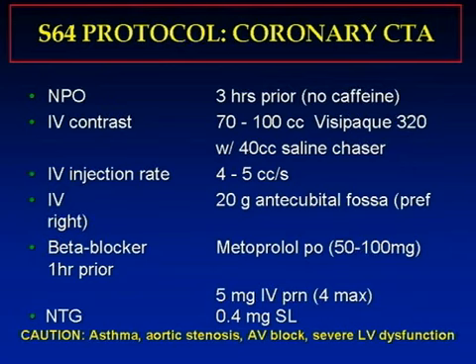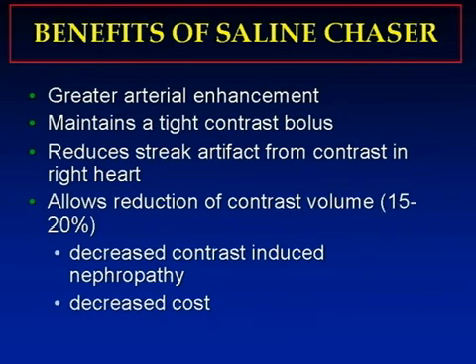And then before we do the study, after we've already set our scanning parameters, we do give these patients a sublingual nitroglycerin to help distend the arteries. Why do we use a saline chaser? Well, there are many benefits, including the fact that you get greater arterial enhancement.